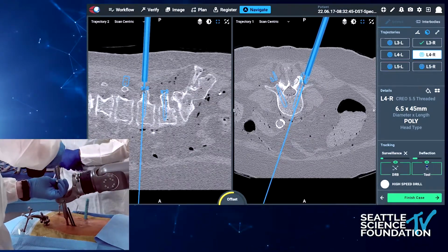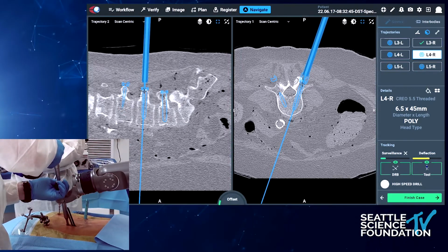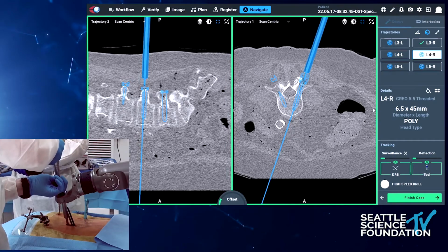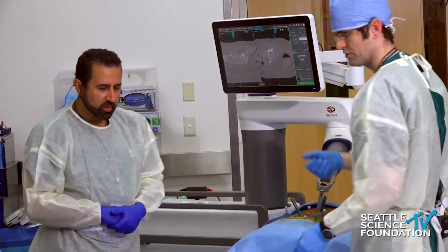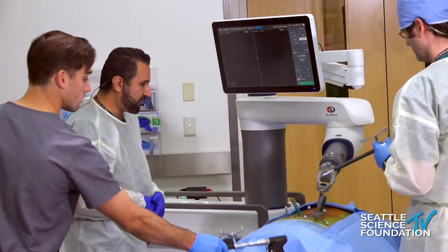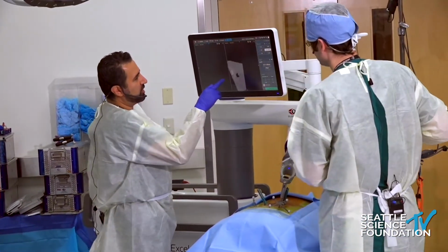Yeah, so one question then about technique. Can you show or try to show what happens if you have a skiving event? So this is a very important safety feature that I think is a technological breakthrough. Would you also try to show how the skiving prevention works? Yes, exactly. Excellent point. So let's demonstrate it on here.